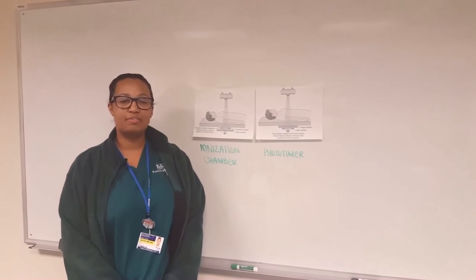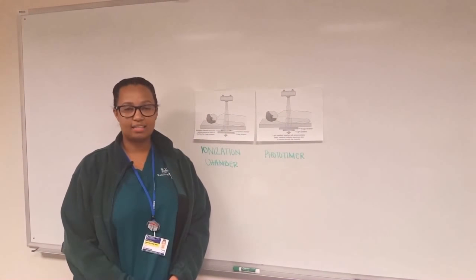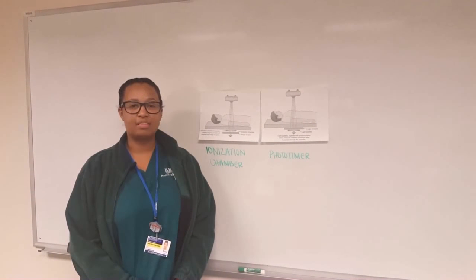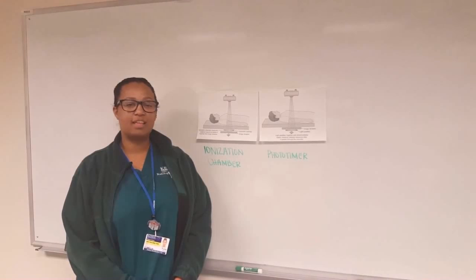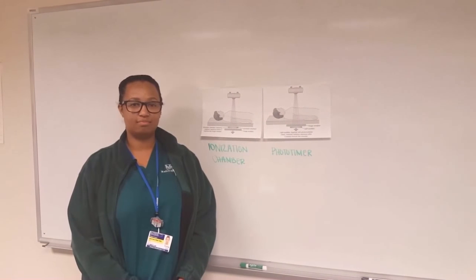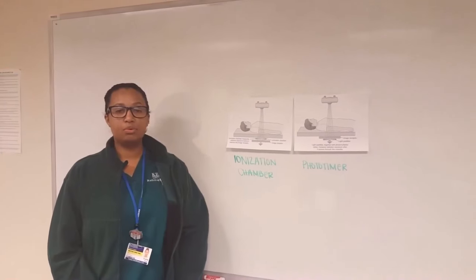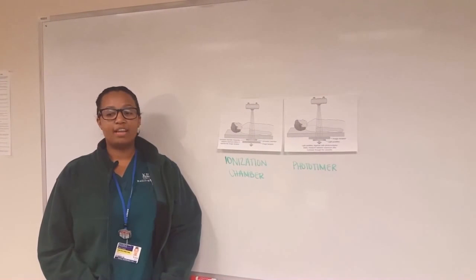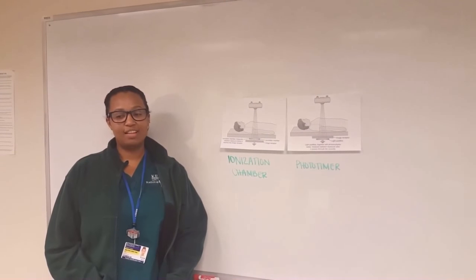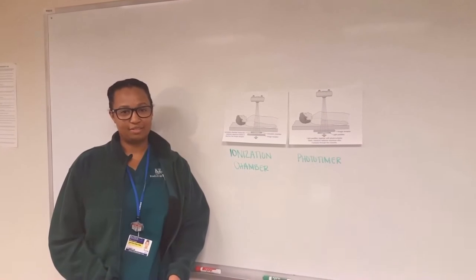I'm going to explain the differences between the phototimer and the ionization chamber. So, the purpose of the AEC chamber is to trigger automatic termination of the X-ray photons when a preset amount has been determined. To quote Johnson and Faber, radiation is transmitted through the patient and converted to an electrical signal, terminating the radiographic exposure.